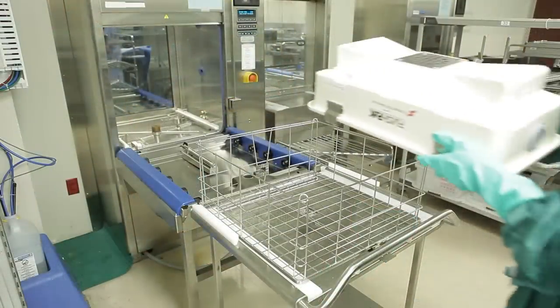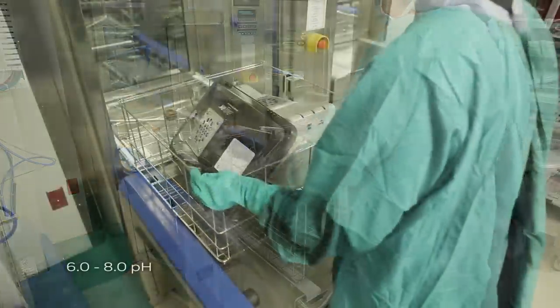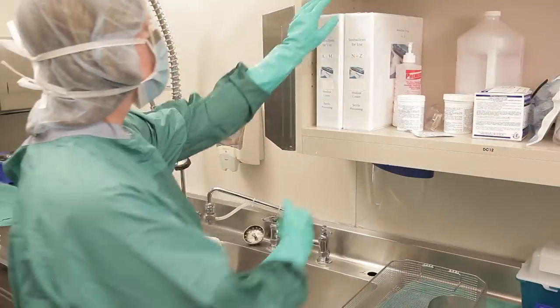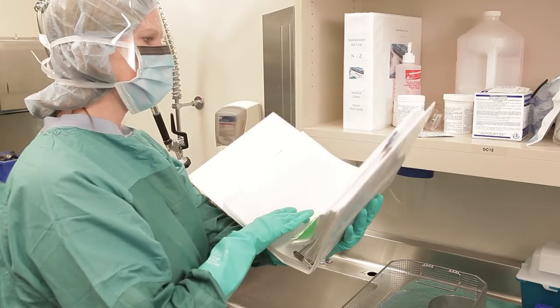The FlashPak may also be cleaned in automated washing equipment using a low-foaming neutral 6.0 to 8.0 pH detergent solution. Be sure to follow your washer manufacturer's instructions and ensure the container is dry before using or storing it.